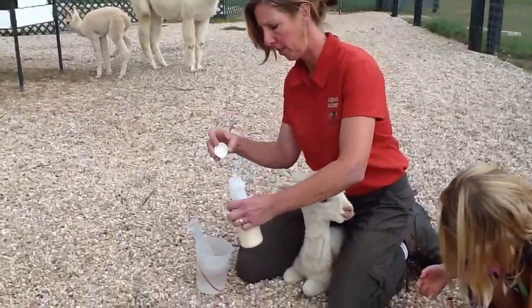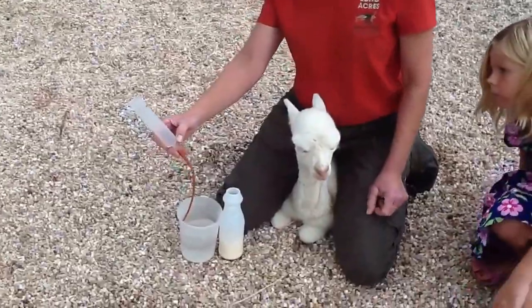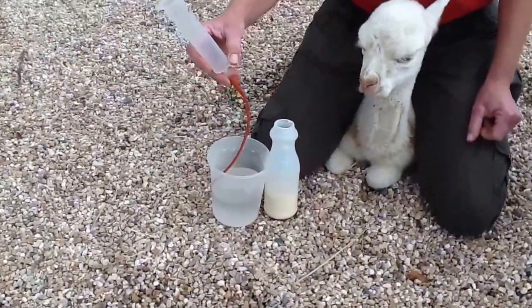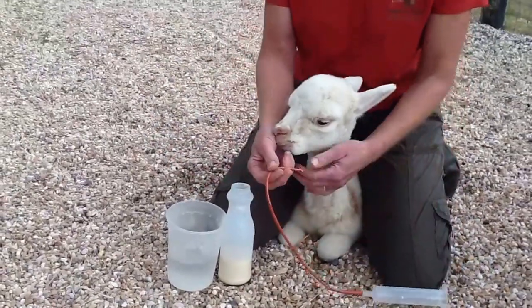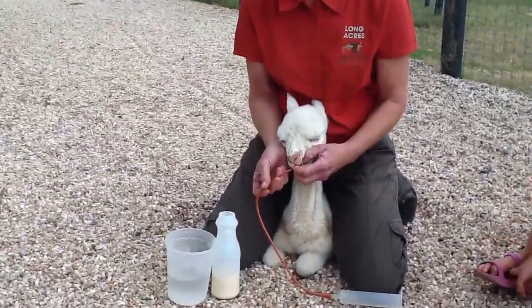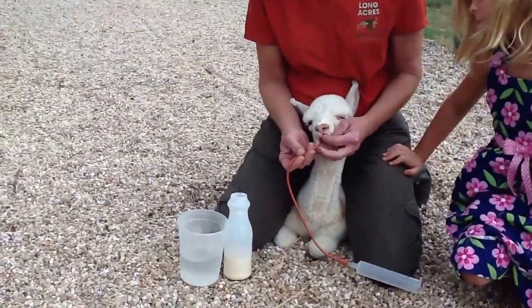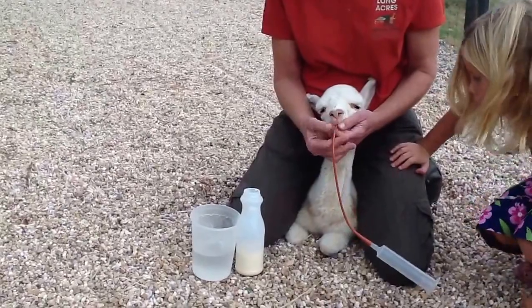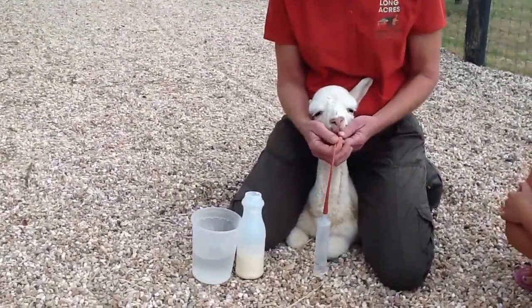I have my milk already mixed up, it's warmed up a little bit, and I just use a graduated syringe on top. I'm just going to pour it in there, and what I'm going to do is I'm sitting over top of him. As you can see, I open up his mouth and insert the tube, and hopefully he'll just swallow it, which is what he usually does, because he's very used to it.